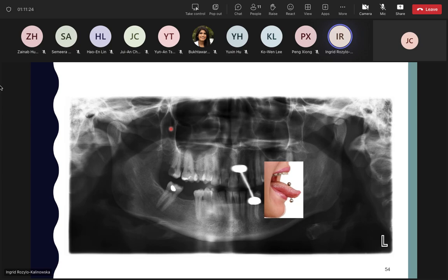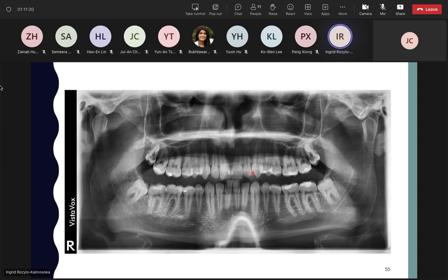So something like that, which also casts a nasty shadow on the radiographed teeth. This is a necklace, but please remember that although you see it in front, it doesn't mean that this is the necklace in the front of a patient's neck. This is in the back. So this is again the ghost image, but of a necklace on the back of the patient's neck.